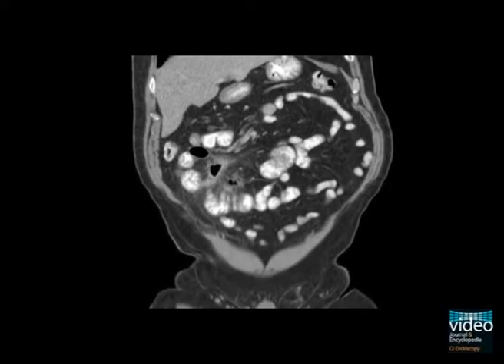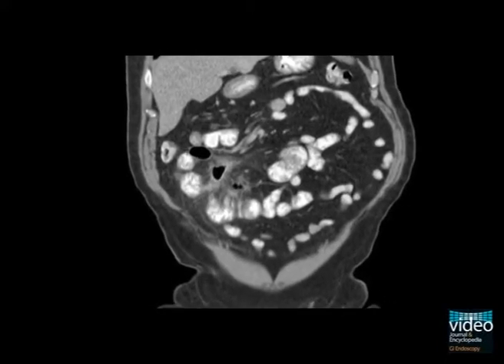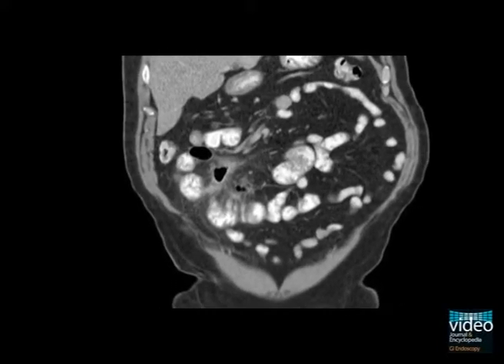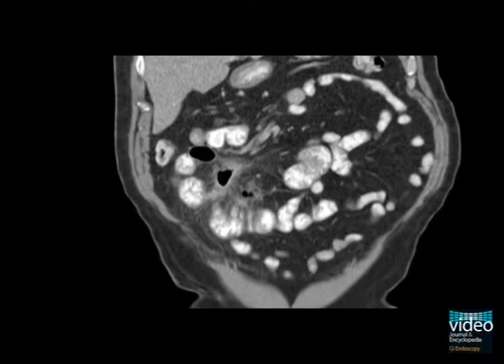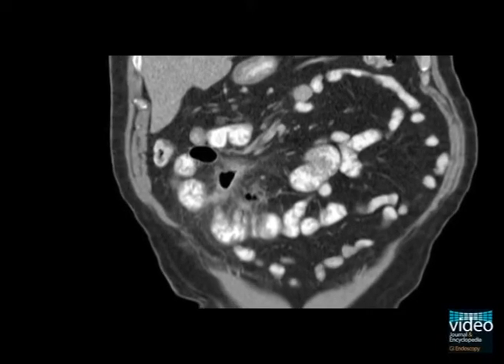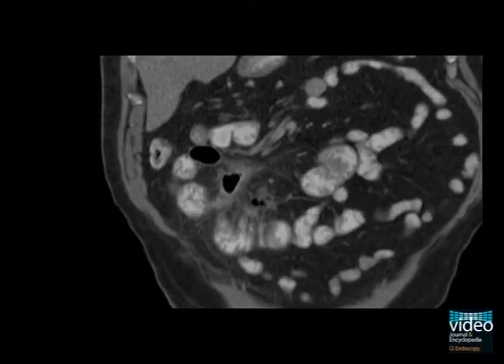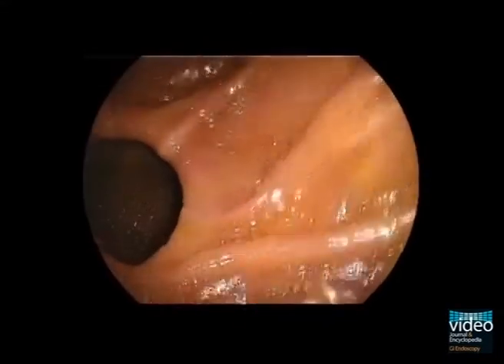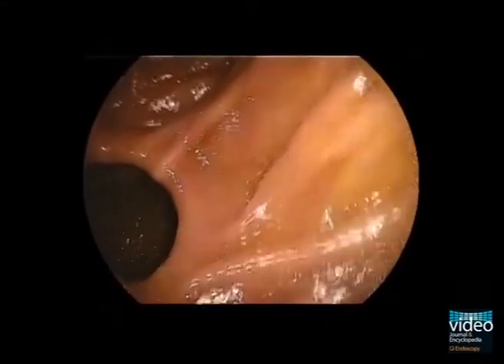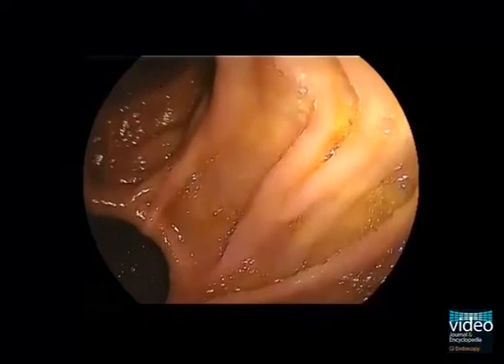Re-evaluation of the CT scan suggested the presence of a jejunal diverticulum. We performed an antegrade double balloon endoscopy to evaluate the presence of a diverticulum and to exclude other causes for his abdominal complaints.